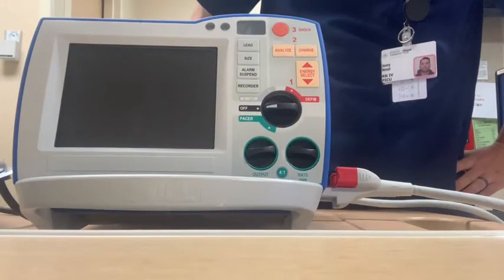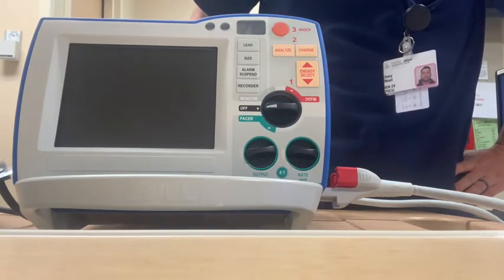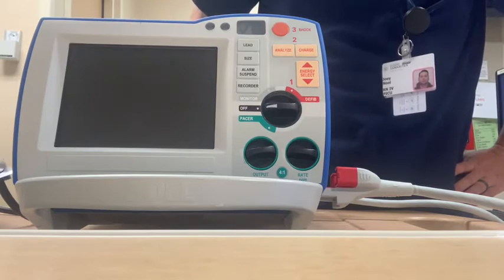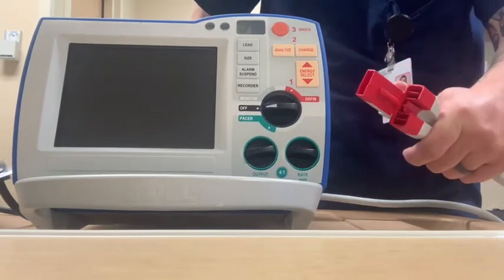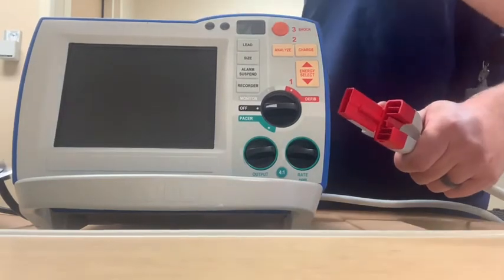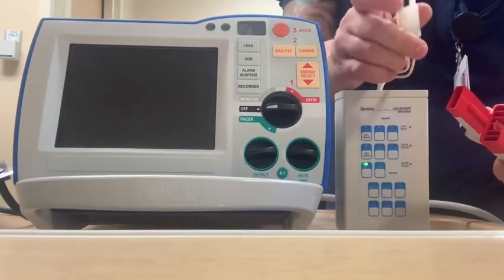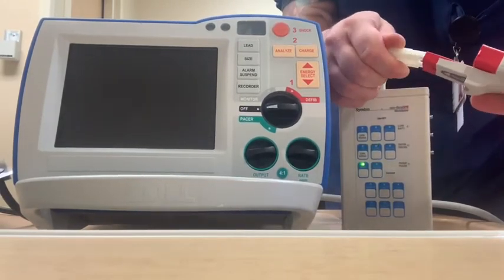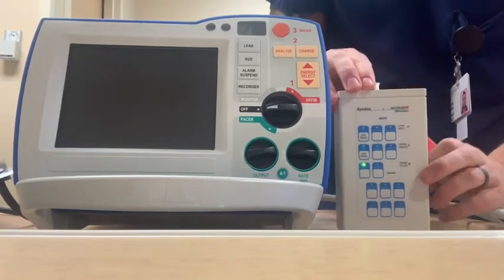Okay everyone, so the first thing I'm going to do is show you how to connect the simulator module so that you can practice reviewing abnormal rhythms and utilizing the Zoll Defibrillator. On the right side, there's this red connector. Now in a code situation, this is what gets connected to the defibrillator pads. For simulation, this is where we're going to connect our module. So it just gets connected like this. Okay, so I have my module connected.